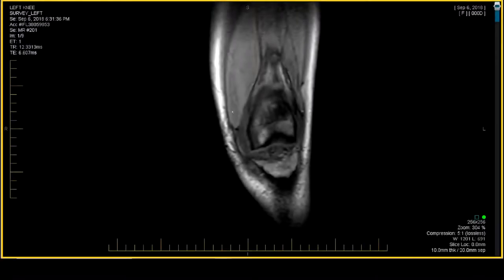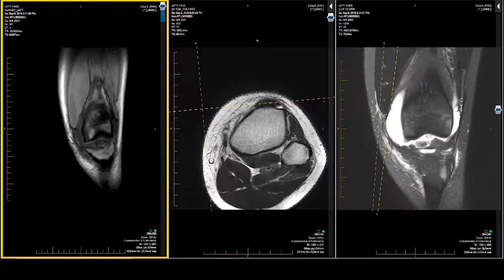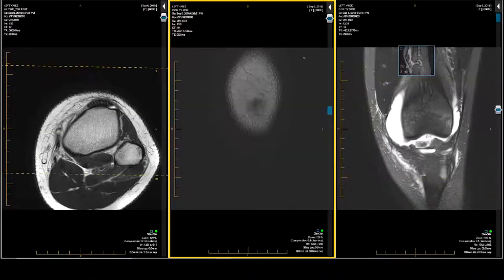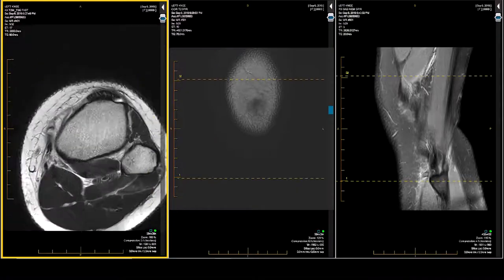This is a 15-year-old female. She had a volleyball injury. We're evaluating for an anterior cruciate ligament tear. I'm going to go three up — you can go two up if you wish. I'm going to pull down my axial, my coronal, and my sagittal water-weighted sequences.